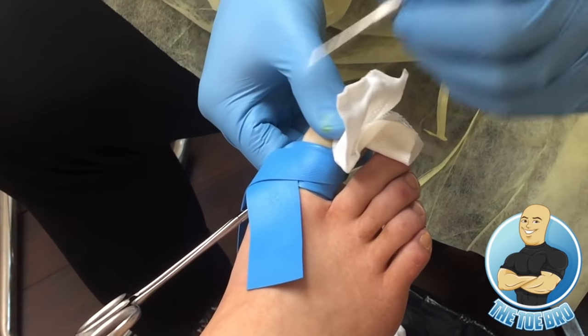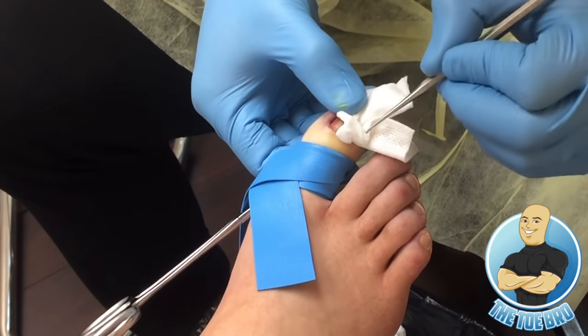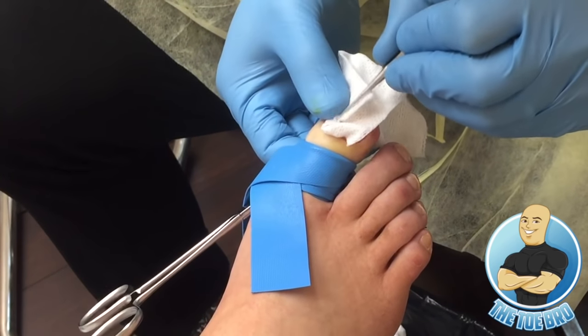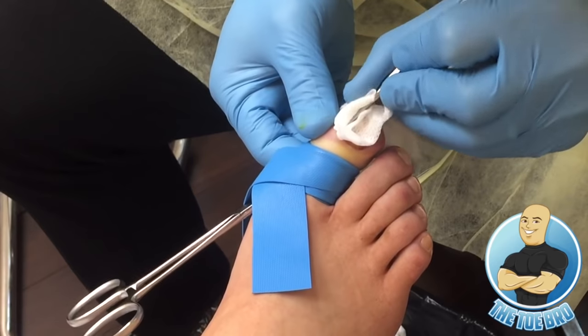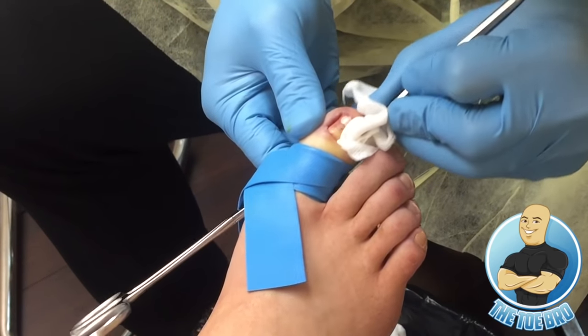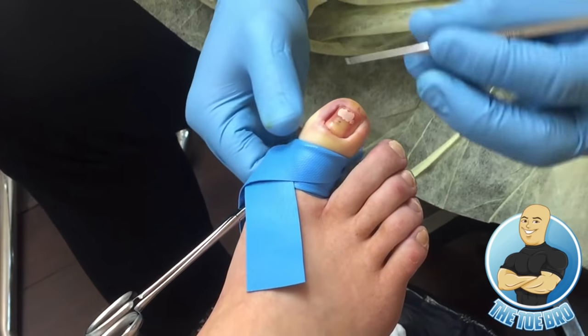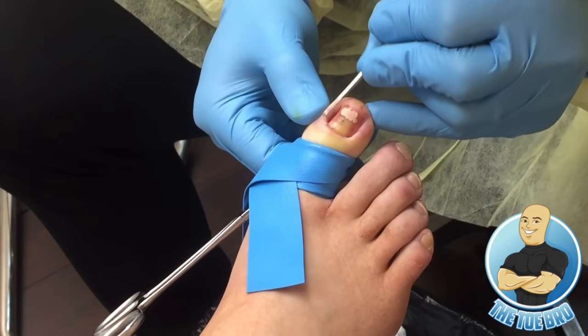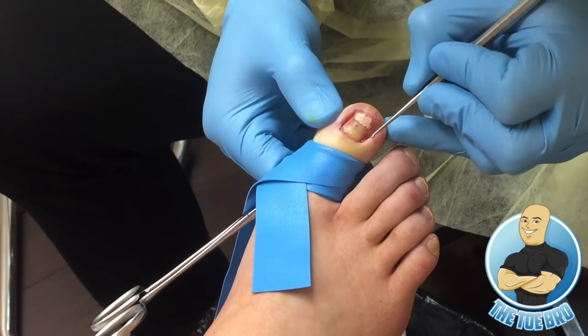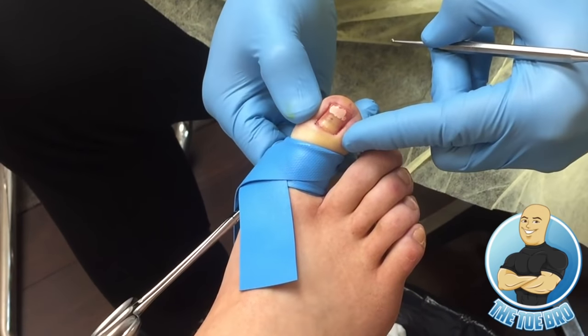This is, again, to prevent any sort of regrowth, to make sure the nail was cut properly and there's no debris left behind which can actually cause an infection or stop the healing. So as you can see, the toe is very, very clean, very bloodless, and this is what we want so that the acid doesn't get diluted. If the acid gets diluted, we can actually get a regrowth of an ingrown toenail, and that's what we don't want to happen.